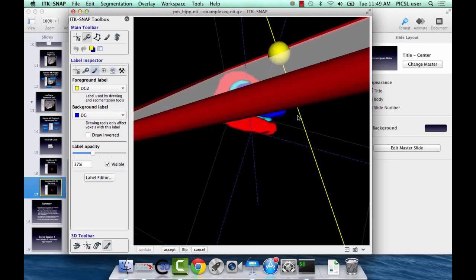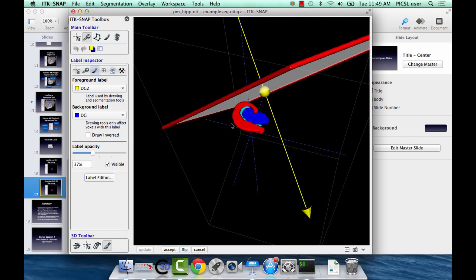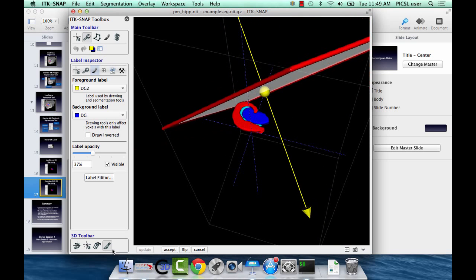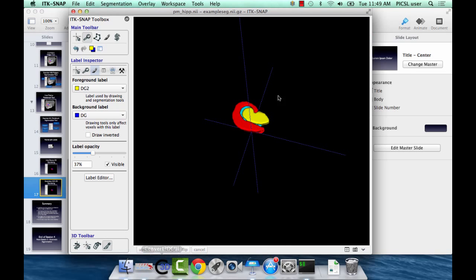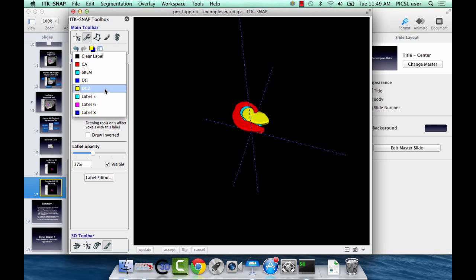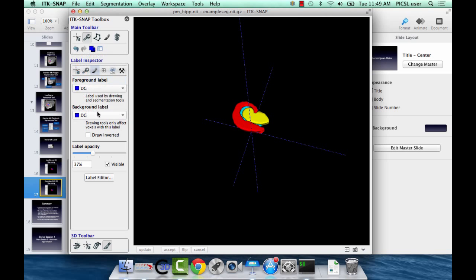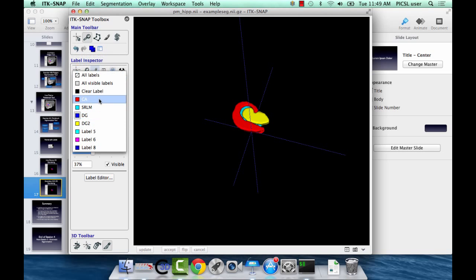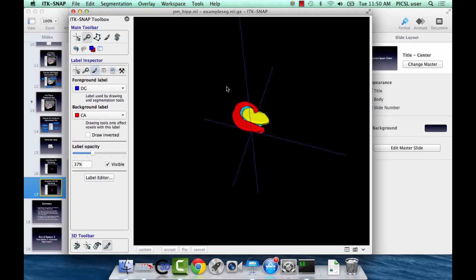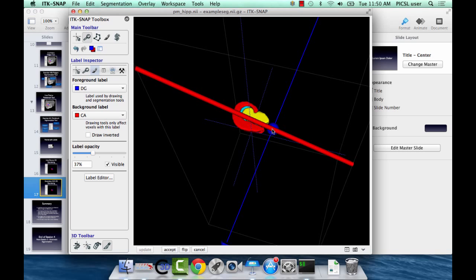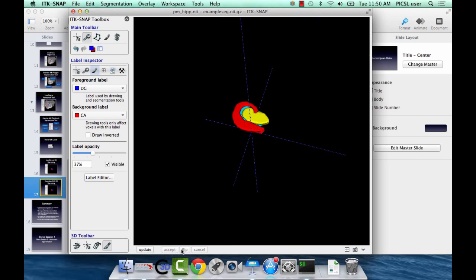So, I could use the scalpel tool to do that. So, this shows you the plane that it will apply this change to. And then, if I hit accept and update, it changes the color. It flips label to whatever your foreground is. It's also a quick way to divide labels. I could cut CA in half, for instance. So, it's kind of like a paint bucket tool in Microsoft Paint. It just fills it in that area under the plane.